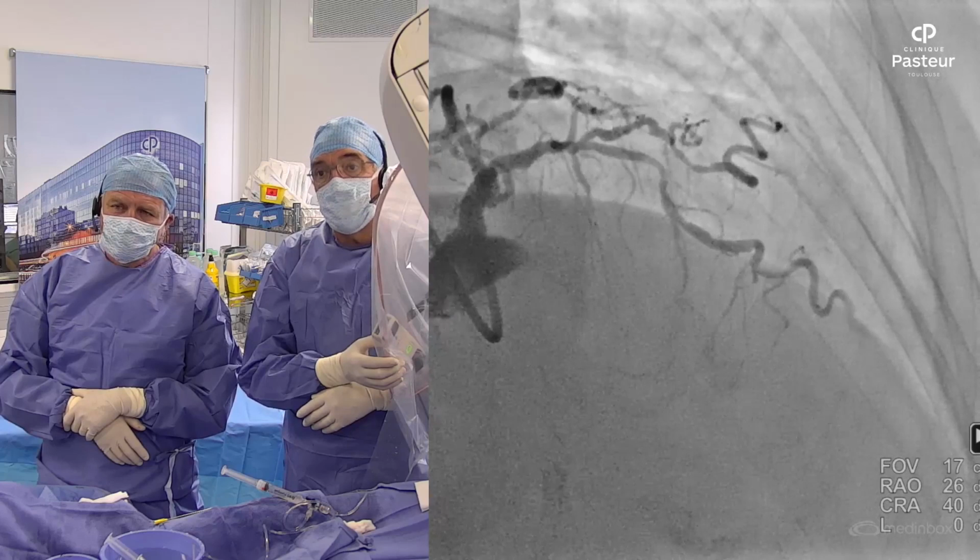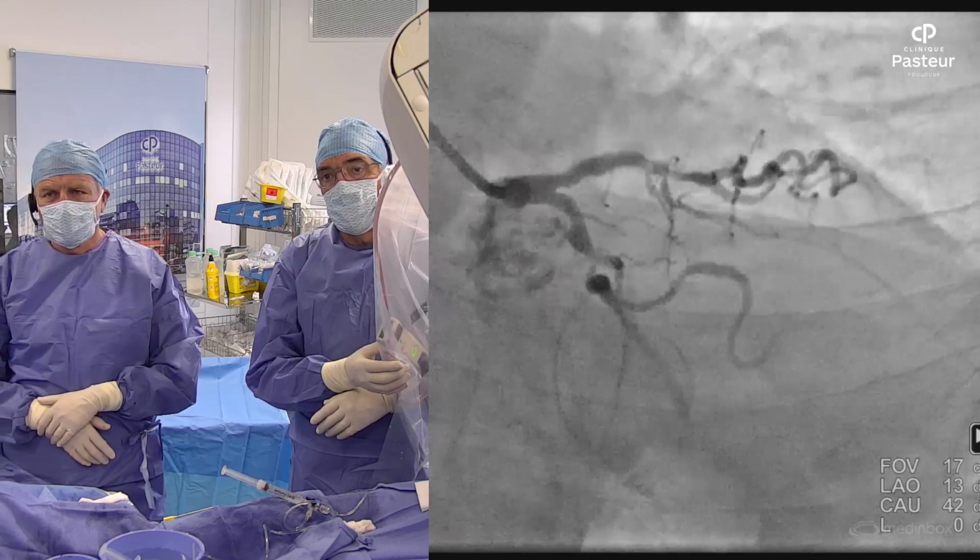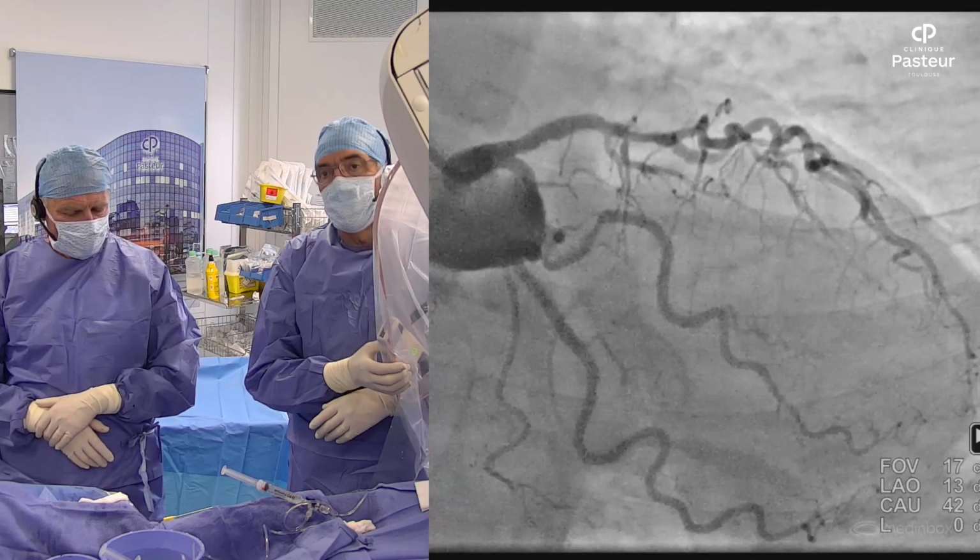But you're right, that's a good question. From what we can see on the angiogram, there seems to be a fair amount of calcification in the vasculature as well. So that circumflex is not going to be particularly easy to navigate stents down, with the tortuosity and the calcification being non-compliant. Can I just ask you, did you experience any difficulty with the radial puncture?